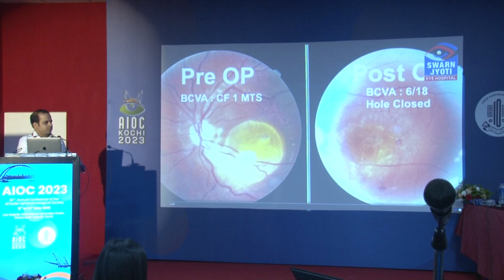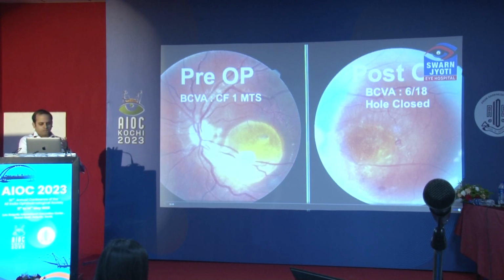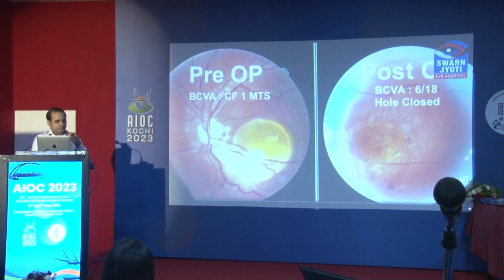Excellent surgery, Dr. Devakant, and very meticulously done. And having a thorough workup is most important before actually going in for surgery. One thing we need to discuss is whether actually lasering that area would have been done, or whether we could have just done an FAX. And secondly, if there is a bigger hole like this, which is very much in the posterior pole and in the macula, whether doing an ILM peel and just keeping it over that would have been an option.